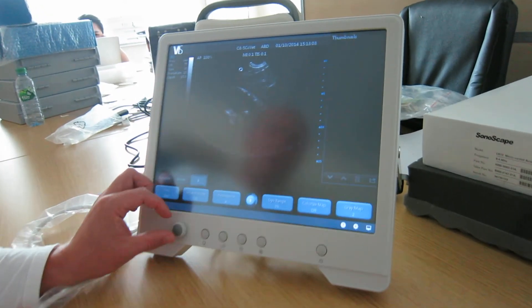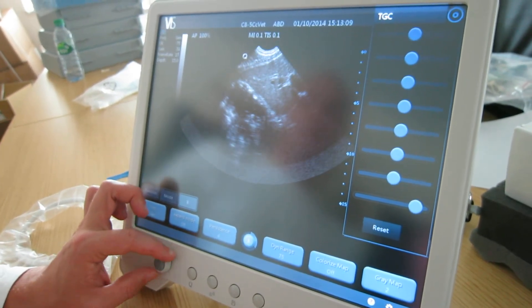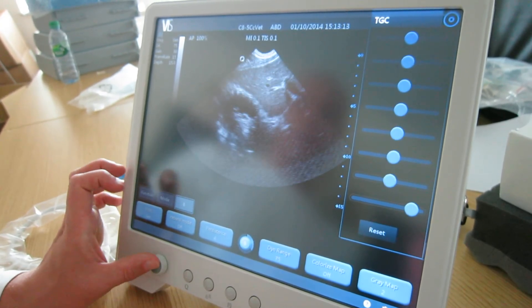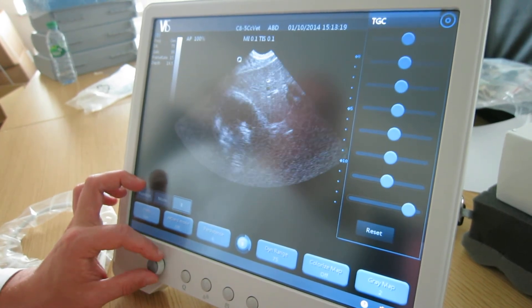The gain setting is using the button and the roll knob. Just turn it to the right and it obviously increases the gain for brightness. Press in once and that changes to the depth configuration, so you're able to go in and out on the depth range.